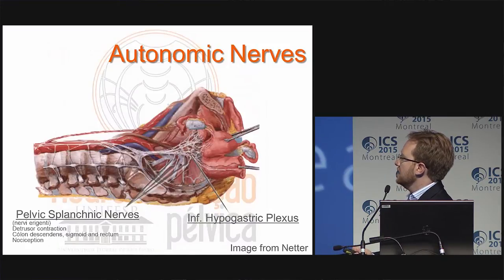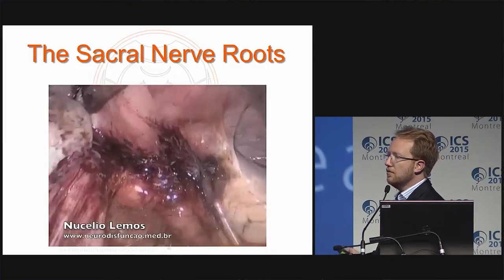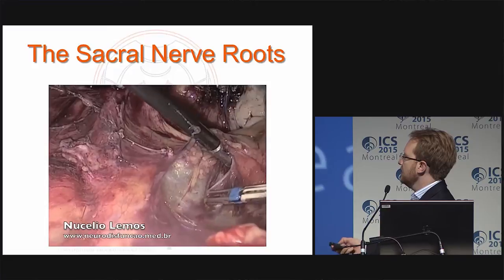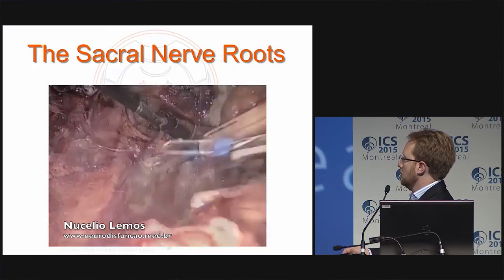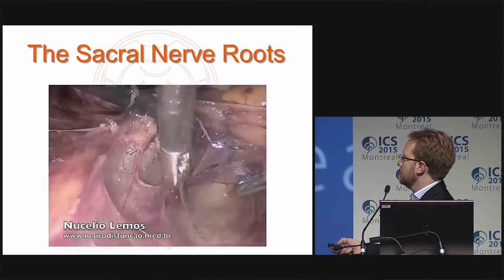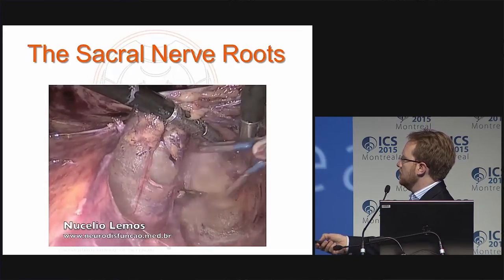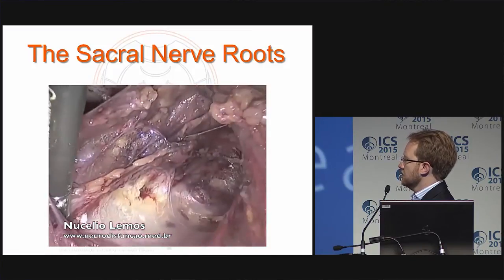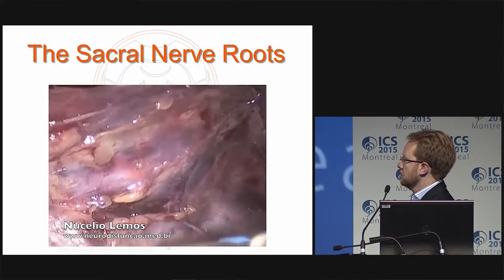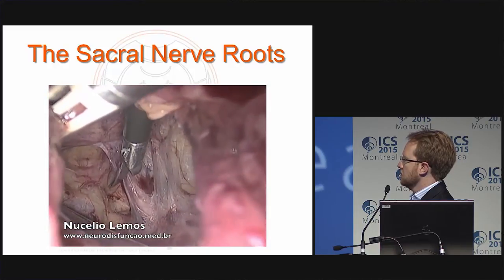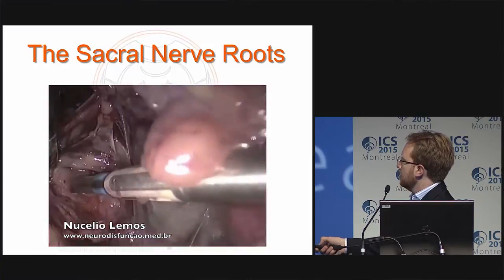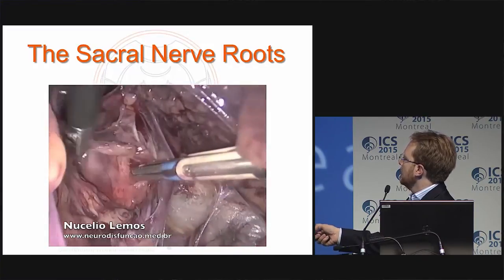Through laparoscopy, we can also dissect the pelvic splanchnic nerves and the inferior hypogastric plexus. This is an endometriosis surgery — I'm only dissecting those nerves to preserve them, demonstrating normal anatomy. I'm opening the pre-sacral fascia, dissecting the pre-sacral space down to the coccyx, then opening the hypogastric fascia laterally. On top of the piriformis muscle we can find the sacral nerve roots and the splanchnic nerves coming out of them.